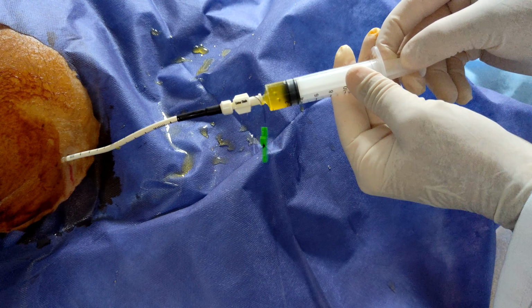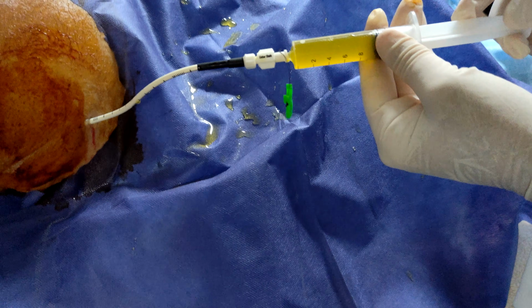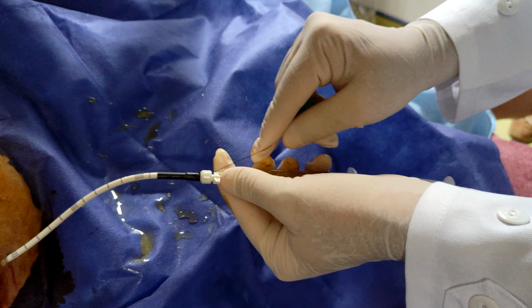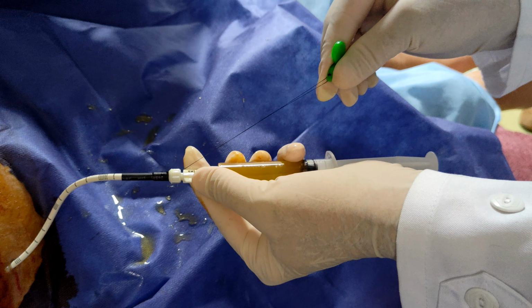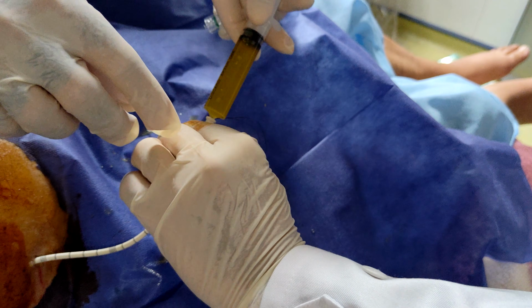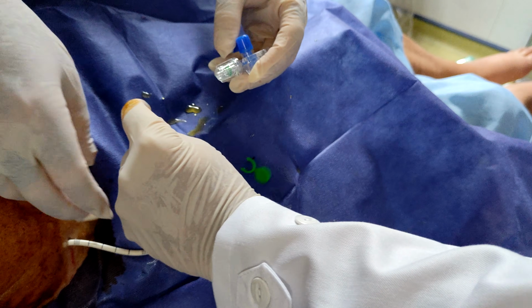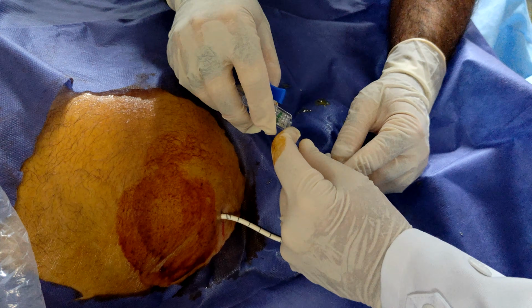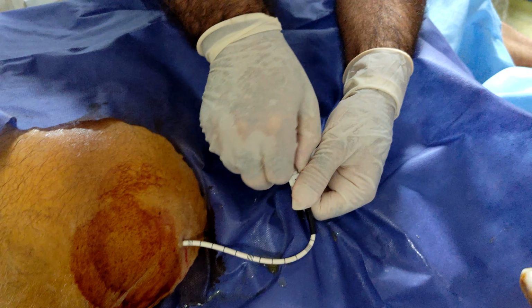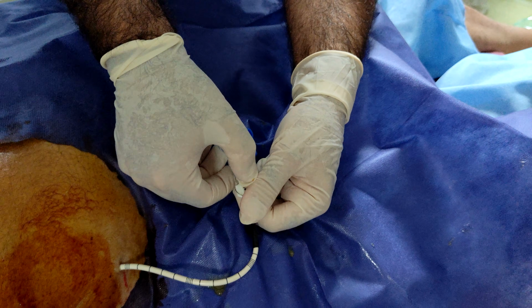After placement, ascitic fluid drainage is started slowly. It is necessary to avoid rapid large volume drainage initially because it may cause hypotension, electrolyte imbalance, and renal dysfunction. Typically, 1 to 2 liters are drained initially, depending on patient tolerance and institutional protocol.